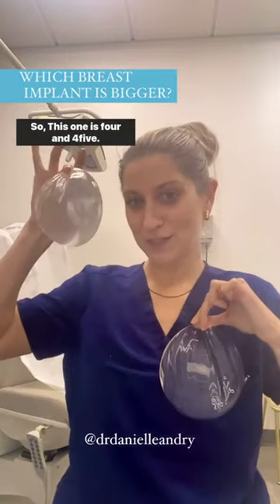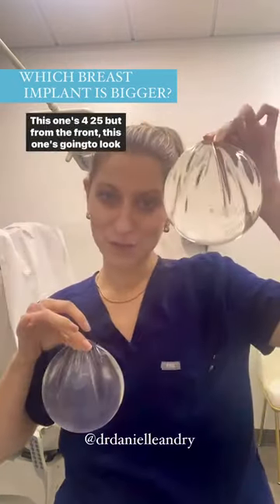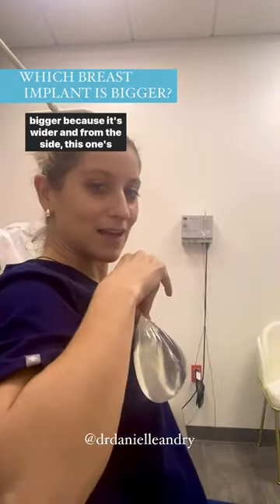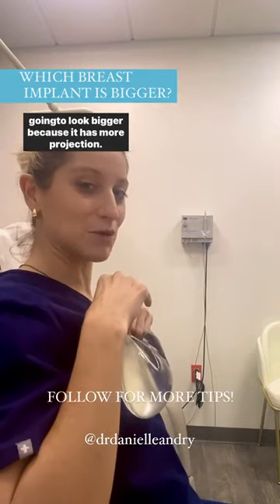This one is 445cc and this one is 425cc. From the front, this one's gonna look bigger because it's wider, and from the side, this one's gonna look bigger because it has more projection.